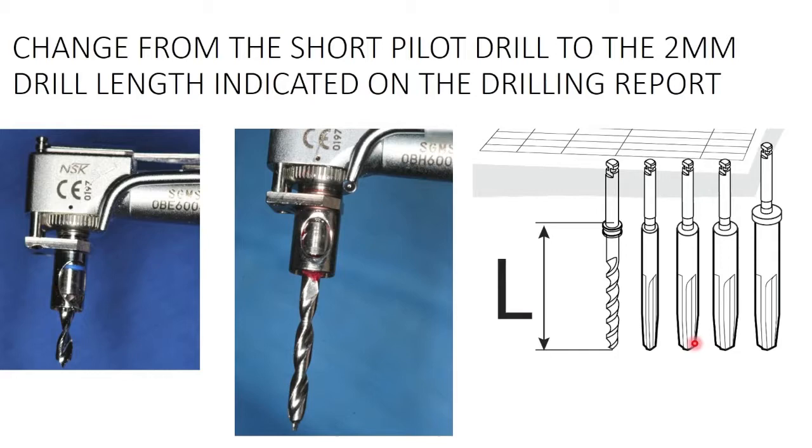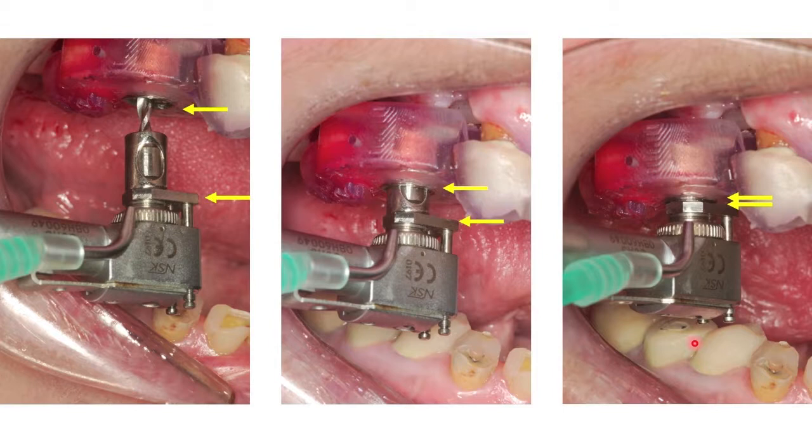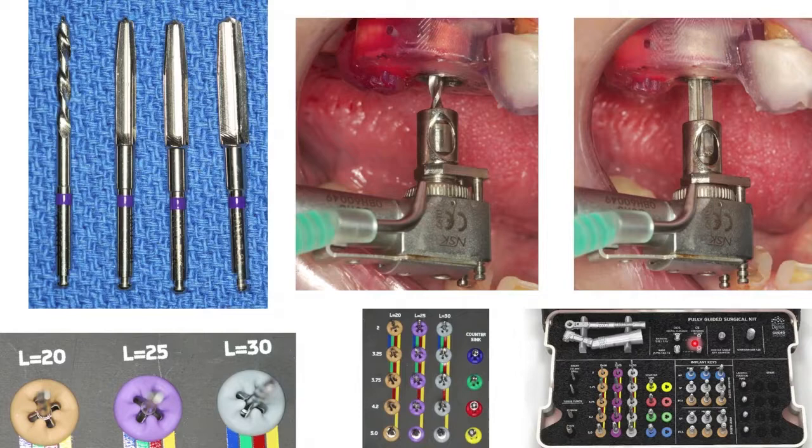So I've used the short two millimeter drill; I'm going to take it out and put in the next size drill — the two millimeter long drill — and drill to final depth, then keep increasing the drill diameter until I get to the diameter of osteotomy that I want. You see it gets seated until the DGS bottoms out — there are no lines I have to look at; I bottom it out every time. These drills all have a purple band because there are three lines of drills: one line is 20 millimeters in length, one is 25 millimeters, and the other is 30. The 20 millimeter drills have a brown or bronze color on the shank, the 25 millimeter drills are purple, and the 30 millimeter drills are silver — and that's how it lays out inside the kit.